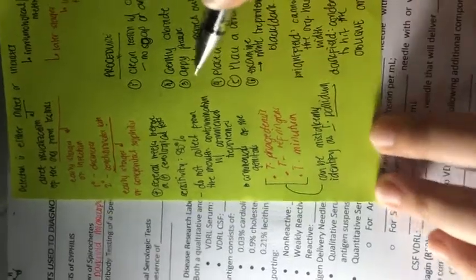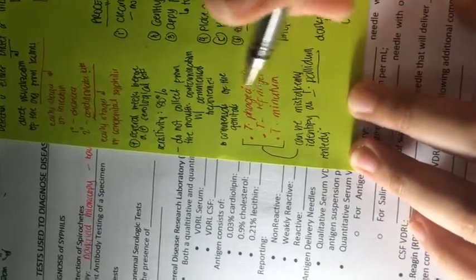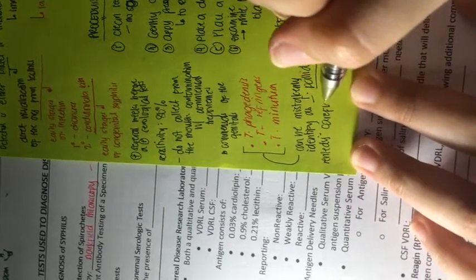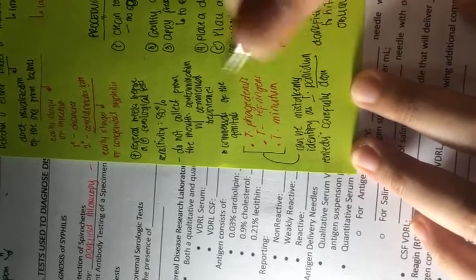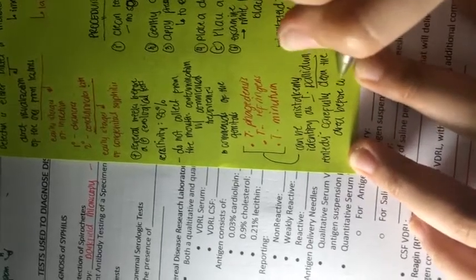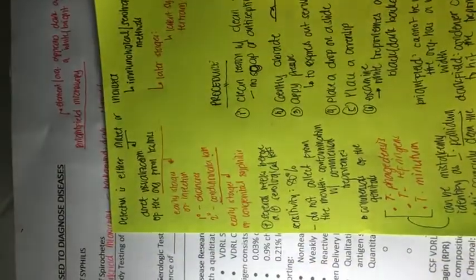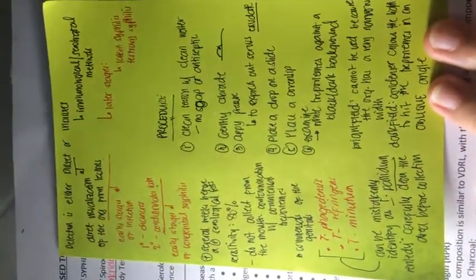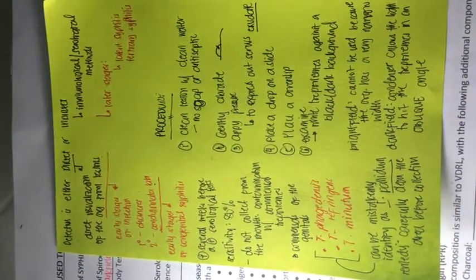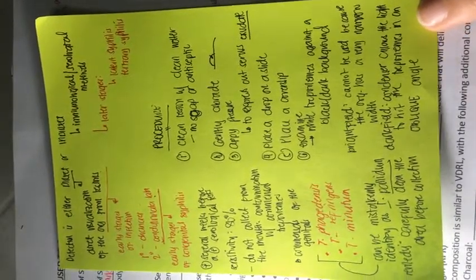So to get rid of the commensals of the genitals, we have a remedy. The remedy is just to carefully clean the area before collection. Just take note that when cleaning the area around the lesion, we should not use any soap or antiseptic, because they can be toxic to our T. pallidum, which are the actual organisms of interest in direct microscopy.